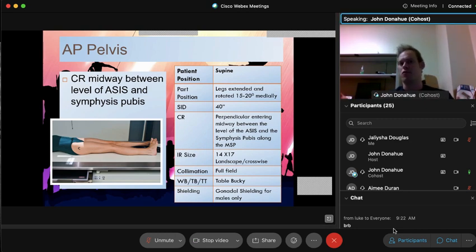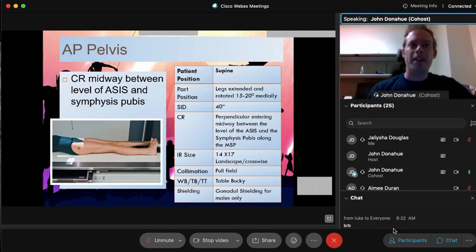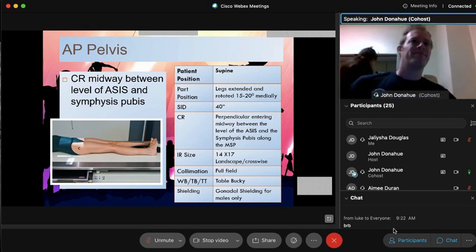So that's an excellent option for you guys. I really suggest it if you're having trouble centering for that x-ray. Because centering can be a big problem on pelvis x-rays. A lot of times people will end up cutting the crest off, so be very careful on that. Look for the top of that light. Be an inch above that iliac crest. That's exactly what you need to do.